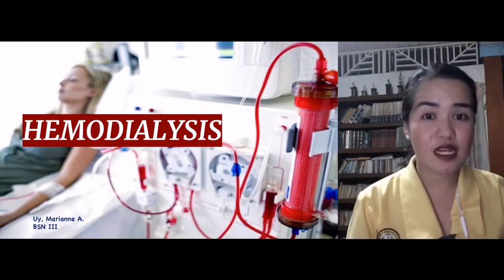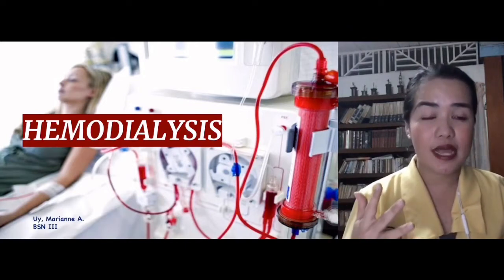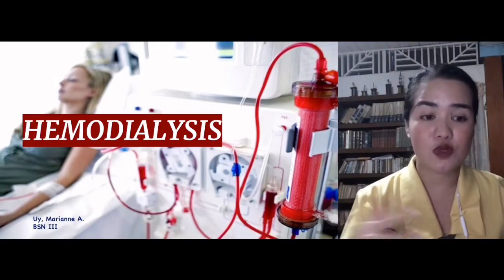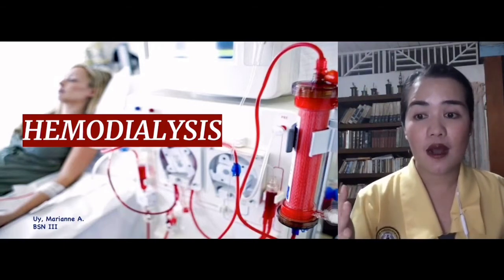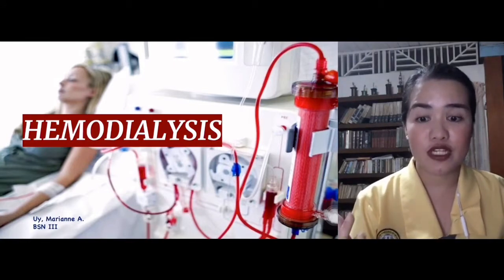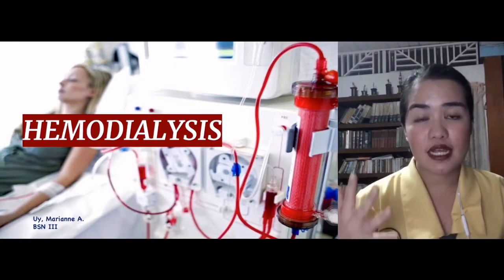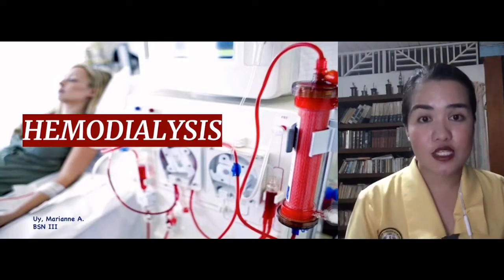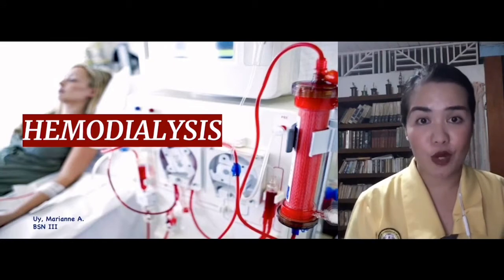What are these waste materials? For example, urea, creatinine, and other electrolytes, as well as excess fluid. Because patients suffering from kidney diseases normally have difficulty passing urine, excess fluid in the body is a common problem.